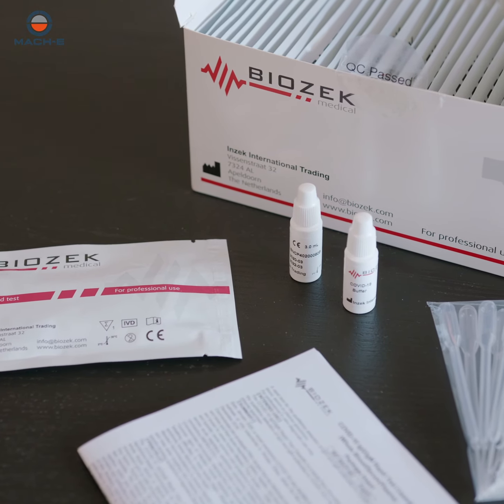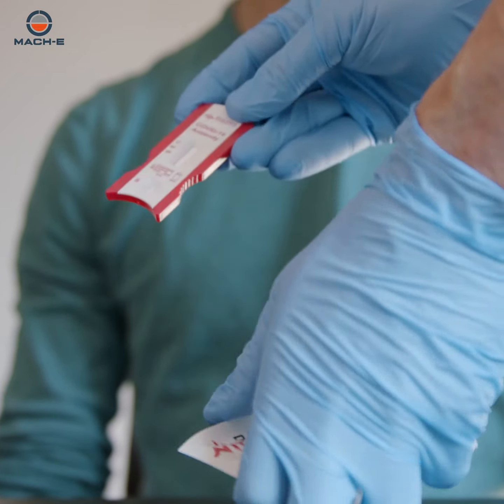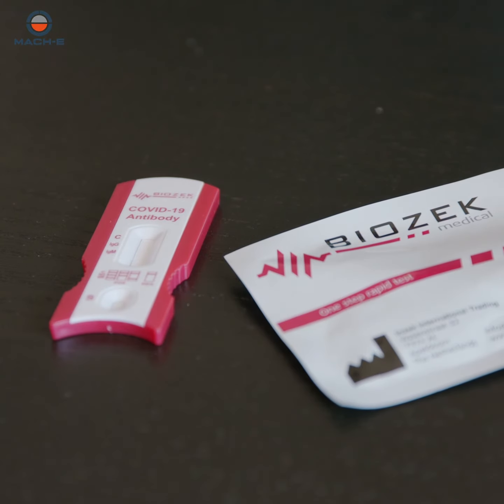Allow the test to reach ambient temperature. Remove the cassette test from the protective aluminum pouch. Place the test over a clean and leveled surface.